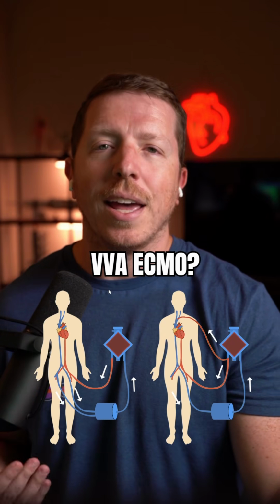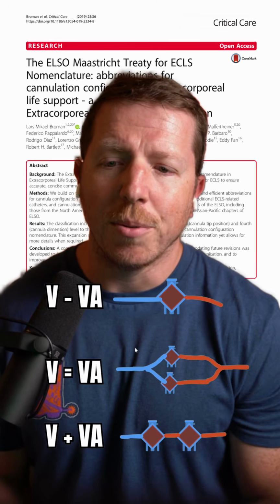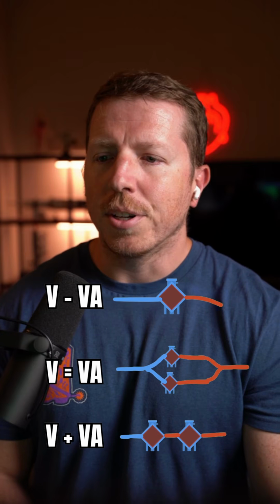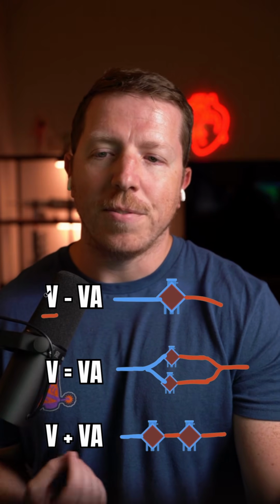And that's why ECMO nomenclature is so important. Now, back in 2019, the ELSO has actually adopted a universal nomenclature so that we can actually determine and differentiate between the different ECMO configurations. So the way that this works is on the left side here, we have our drainage cannula or cannulas. So we have a venous drainage site over on this side.